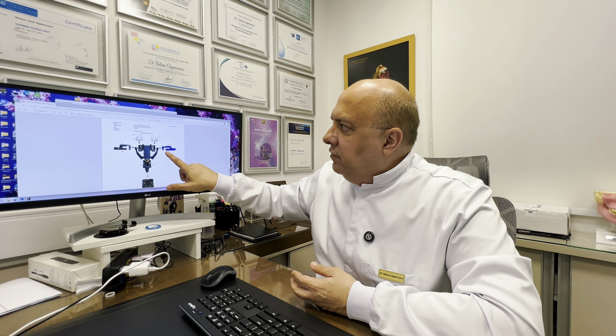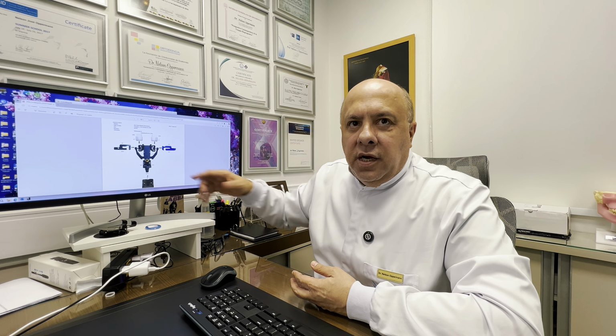And this left side gives me an insert to recreate or to copy what's going on inside the joint. On the left, it gives me this blue one, which is arthrotic. It's like a straight movement. On the right joint, I don't have that curve, but I have certain posterior movement being reproduced on that insert, which is the black one. And Bennett movement, 10 degrees here, 1 degree here.